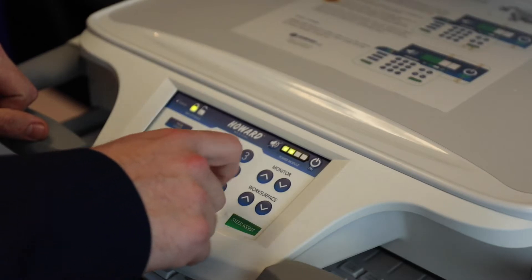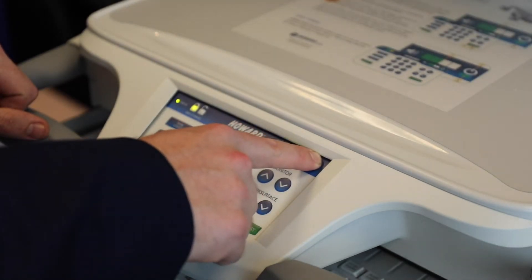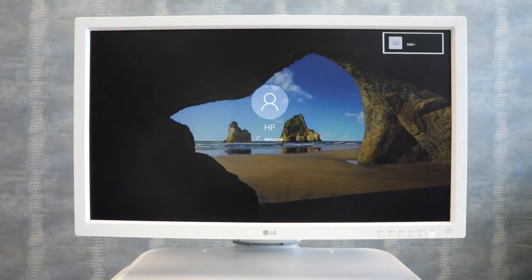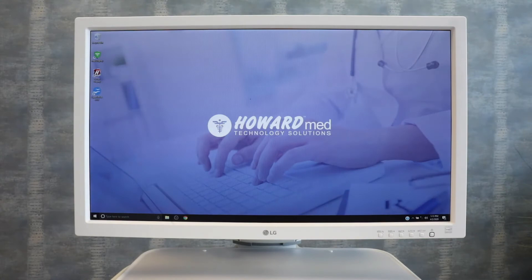Power on your computing device by pressing and holding the AC power button located on the upper right-hand corner of the keypad. You will hear an audible beep from the keypad, the on button will illuminate, and the computer will boot.